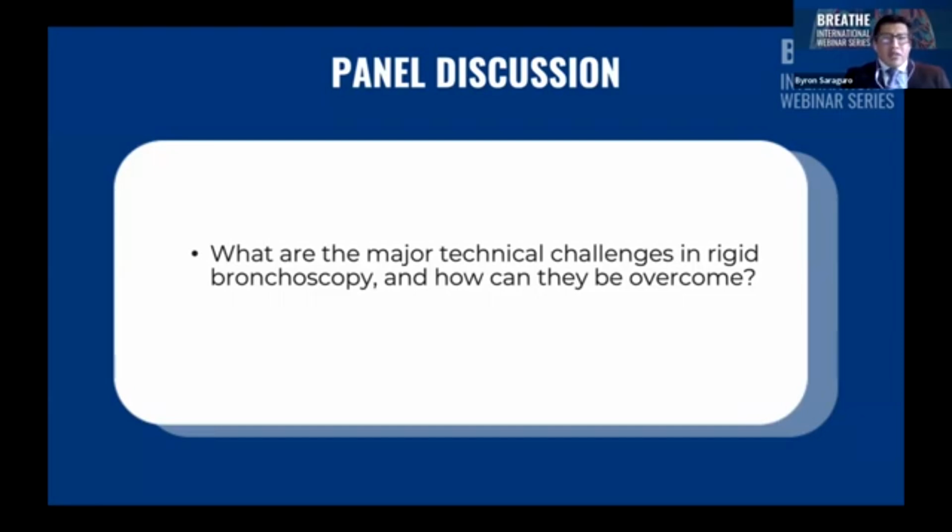For example, when this procedure is new to an institution, it's advisable to perform several well-rehearsed simulated cases with the operators, anesthesia team, and nursing staff present. This will familiarize each with their crucial role. The procedural plan should be rehearsed and discussed between all staff members.